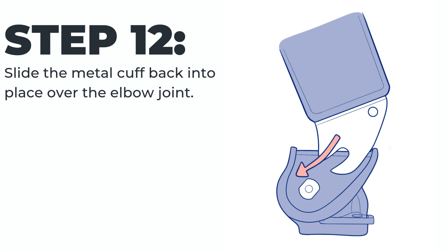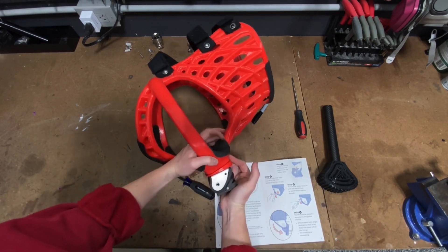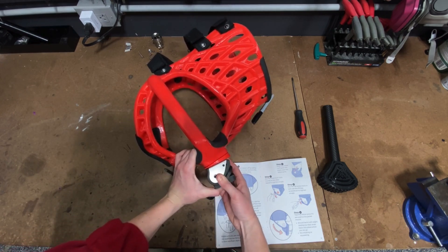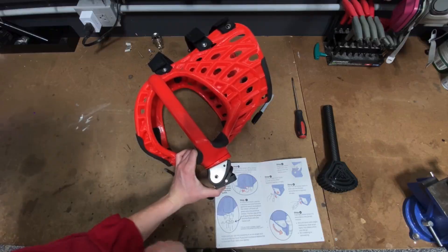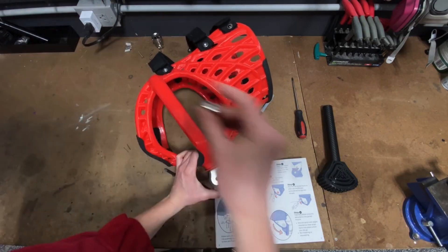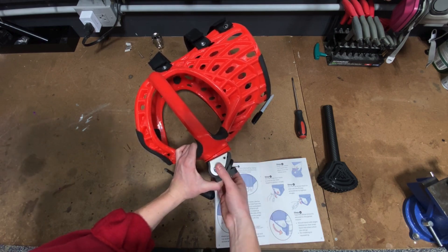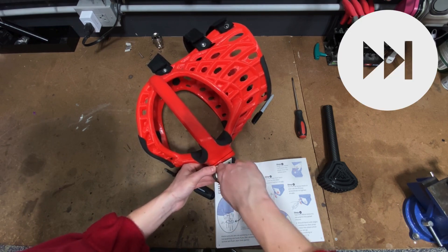Step twelve: slide the metal cuff back into place over the elbow joint. The cuff will slide in right behind the tension bolt, so you do not have to remove it. Step thirteen: put the main bolt back in and use the allen key to tighten snugly. Be careful not to push the tension bolt out of place while doing so. Make sure you are not screwing in on an angle. If you feel resistance, back the bolt out and start over gently. The best way to make sure the tension bolt isn't backing out is to place one hand on it while you're putting the main bolt back in.